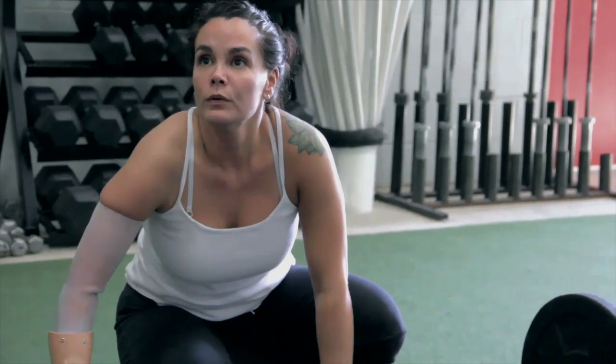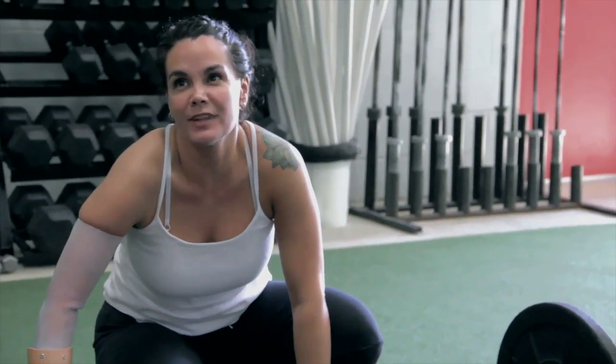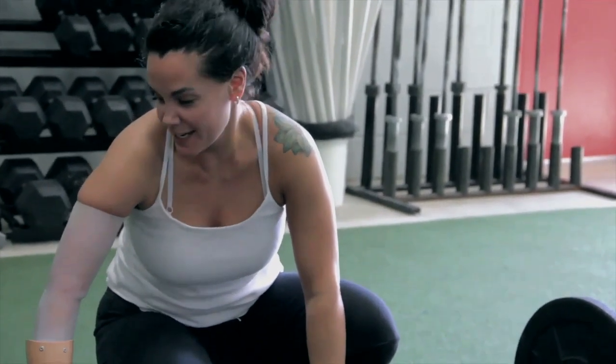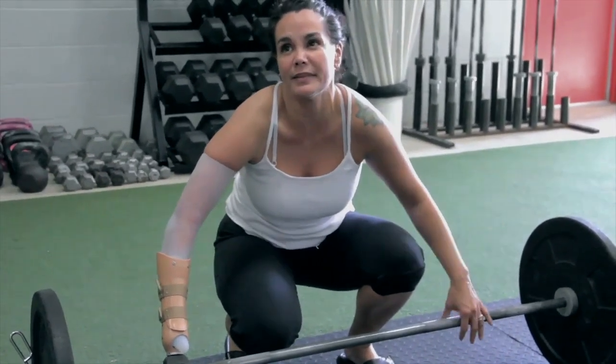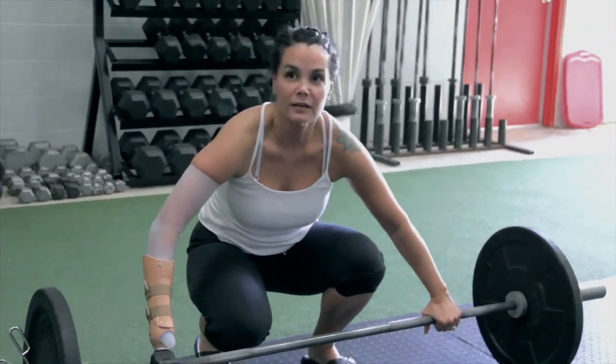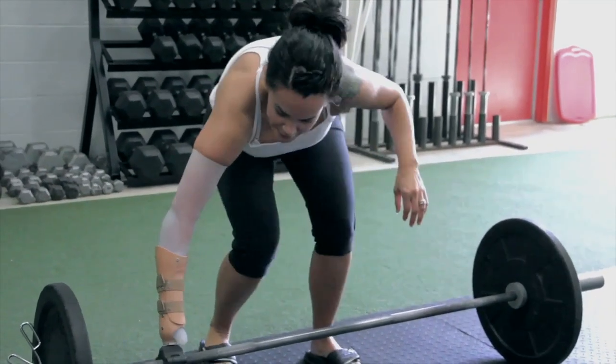It's not pulling. I really can't tell the difference. The only thing I can tell is it's tighter — I can't tell the length. More comfortable than the other one? Yeah, it's so tight.